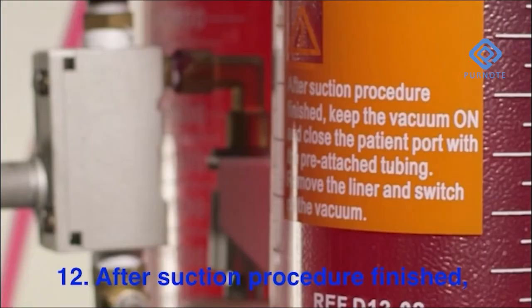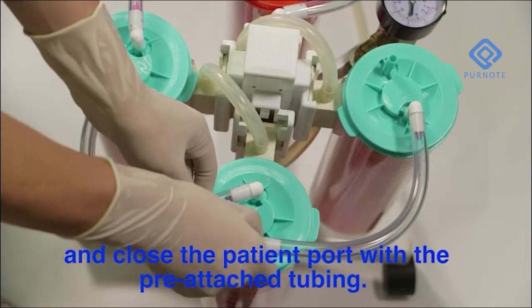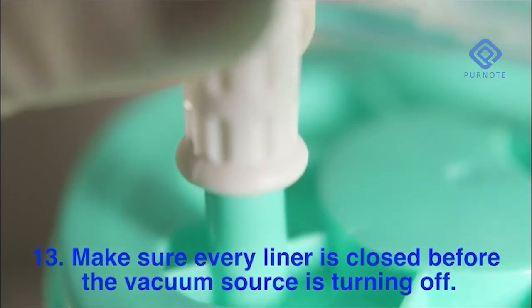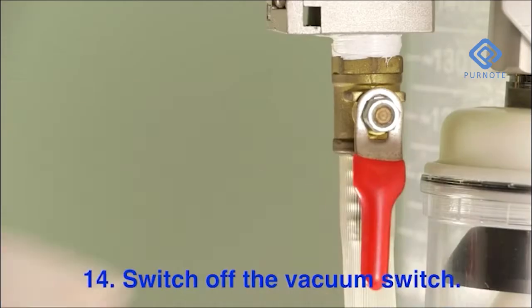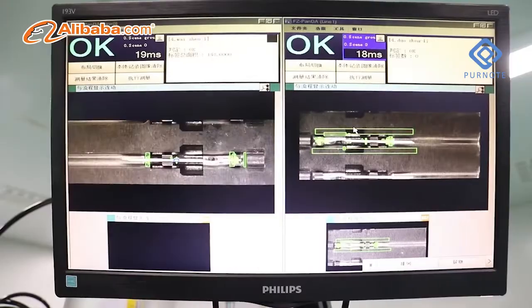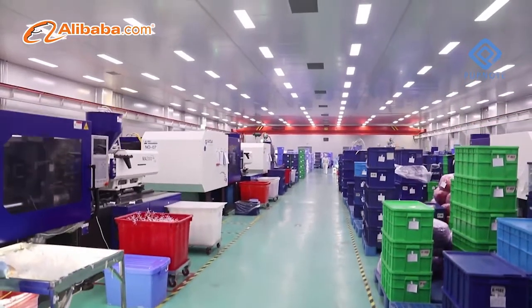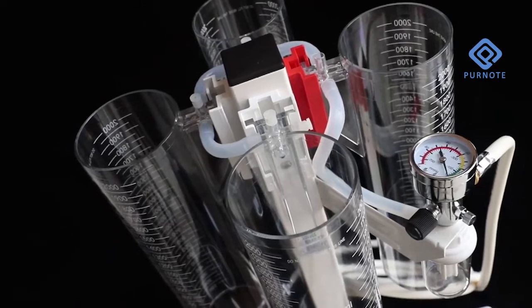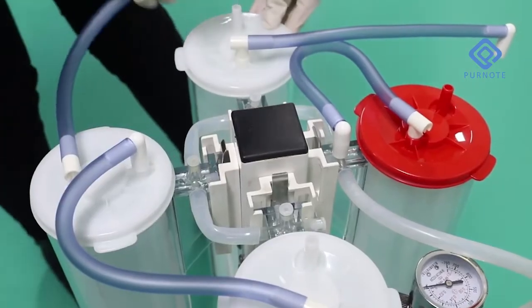After the suction procedure is finished, keep the vacuum on and close the patient port with the pre-attached tubing. Make sure the liner is closed before the vacuum source is turned off. Switch off the vacuum switch. Thank you.